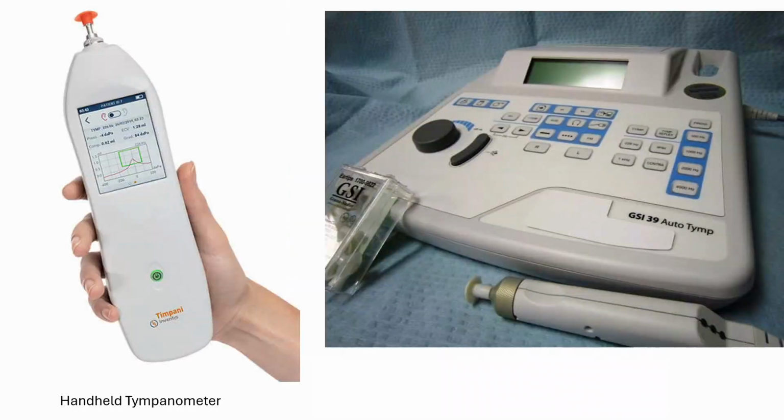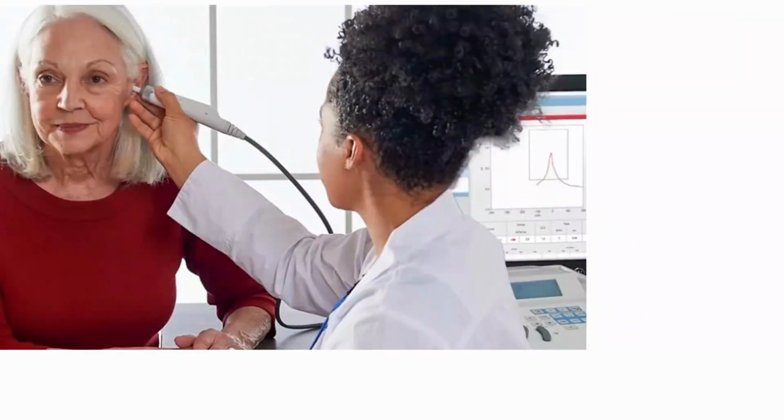There are other types of tympanometers as well. This is a handheld tympanometer, so you can carry it anywhere, and this is the other machine. For that other machine you just have to put the probe inside and don't have to push any button, and it will automatically plot a graph.